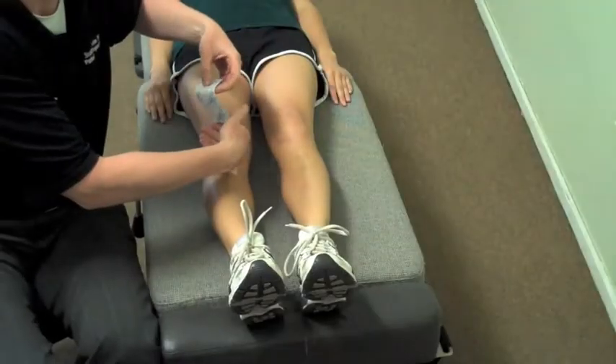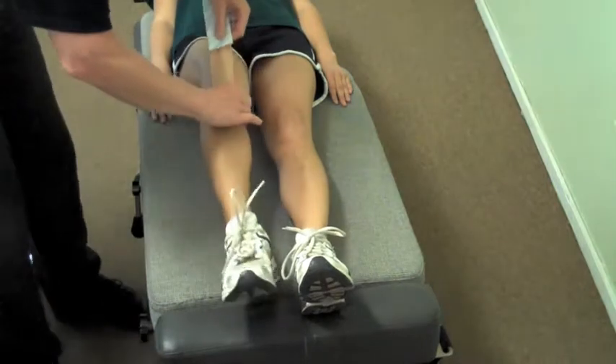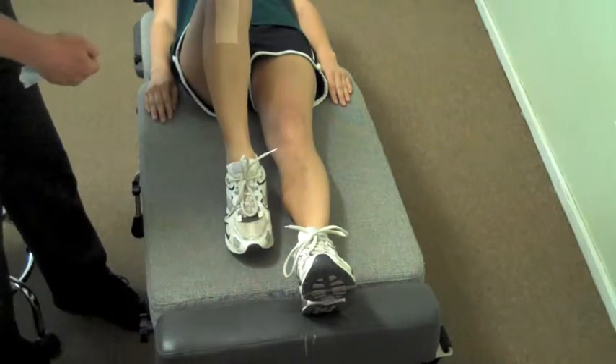We're going to do light tension over the patella, and we're going to have the patient bend their knee as we go over, and then we're going to put down the pole of the patella with no tension.